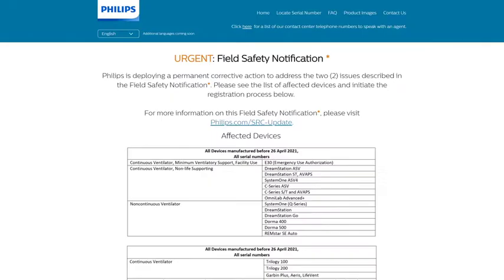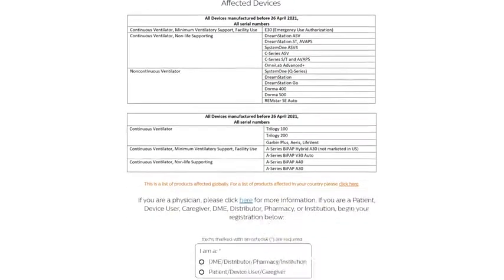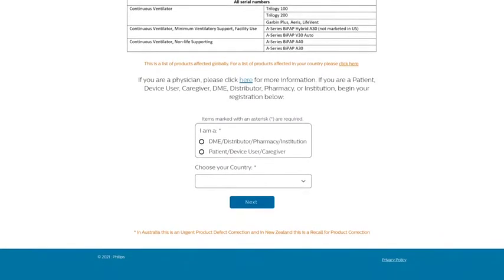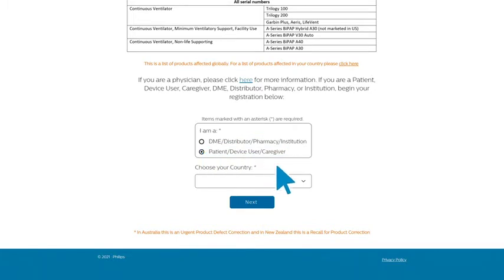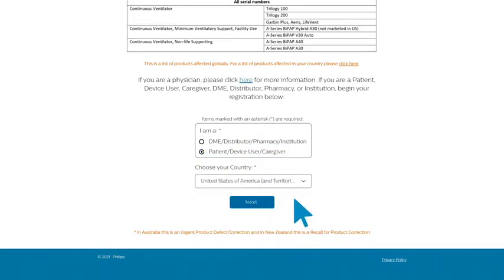This will open a new tab. Read through the page information. To begin your registration process, select 'Patient Device User Caregiver' from the list. Choose your country location and click Next.